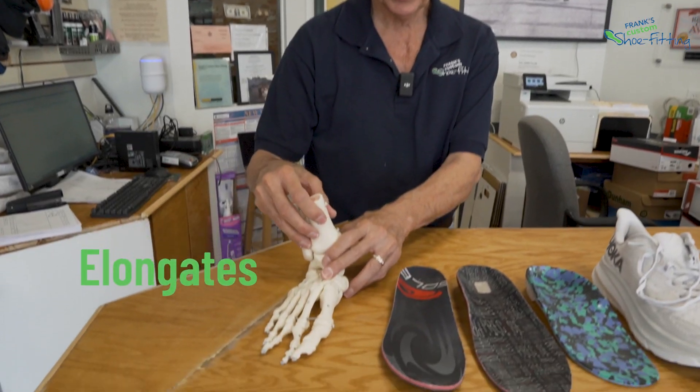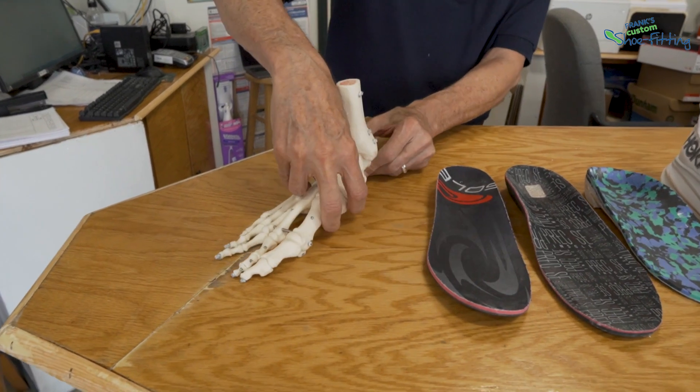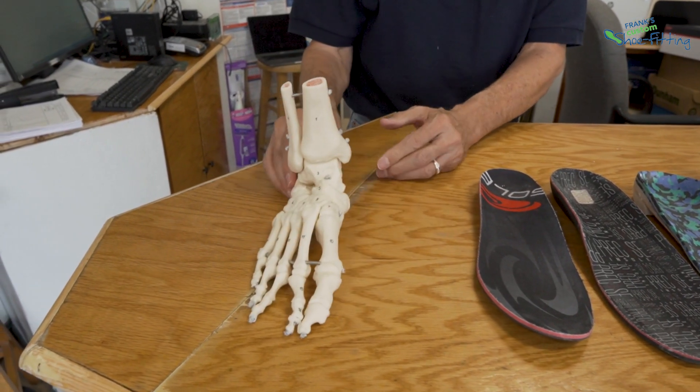I'd like to talk to you about why some orthotic types fail and others work. Remember that the foot is a tripod. It elongates, it pronates, even over-pronates for our storytelling purposes.